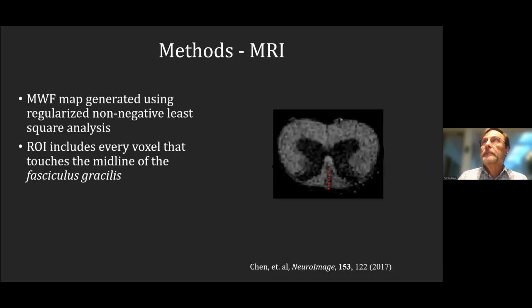Going through quickly because I'm slowly running out of time. For the myelin water fraction, we took the region of interest that included only the pixels immediately adjacent to the central part of the fasciculus gracilis, like shown here.